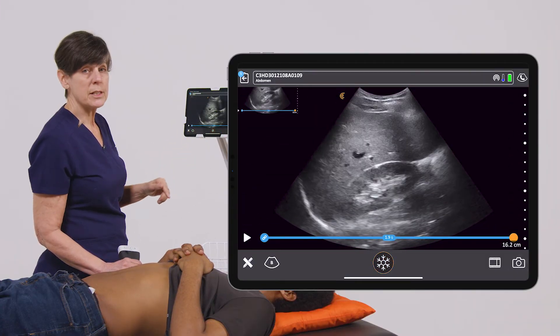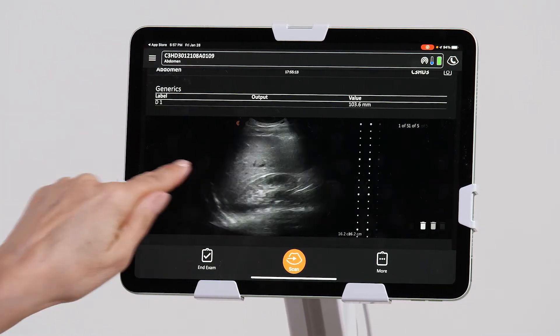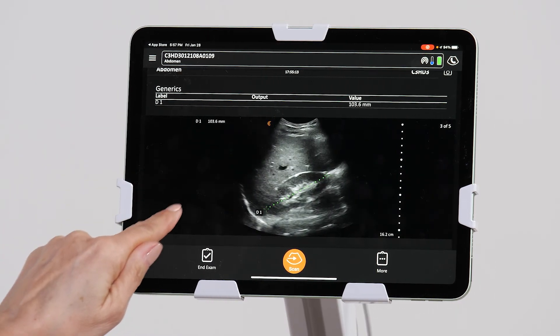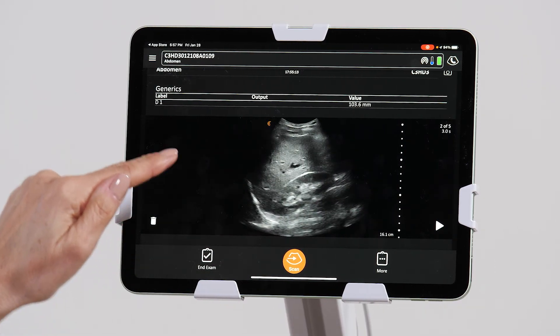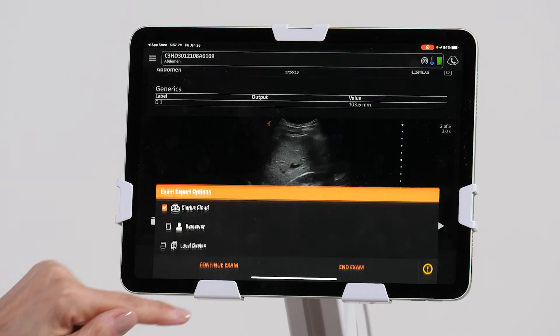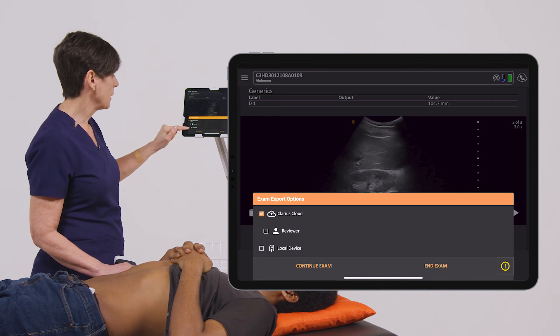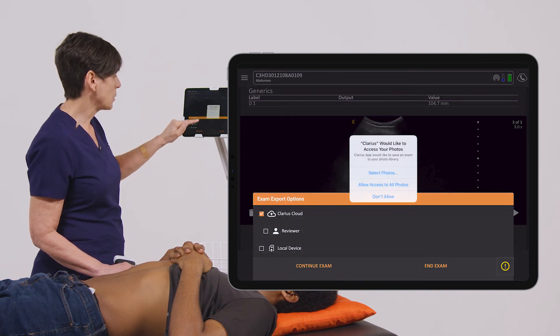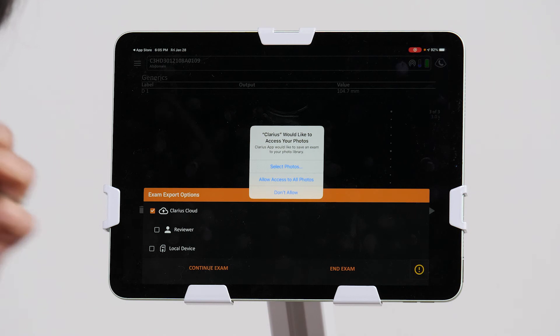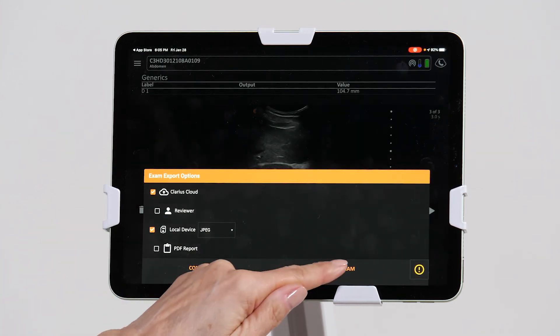Now once you've completed your exam, you can go to the report page, review your images, delete the ones that you don't want, and when you're happy with your results, you can hit end exam, where I can choose to upload my images to the Clarius cloud, save them on the local drive, and then end exam.